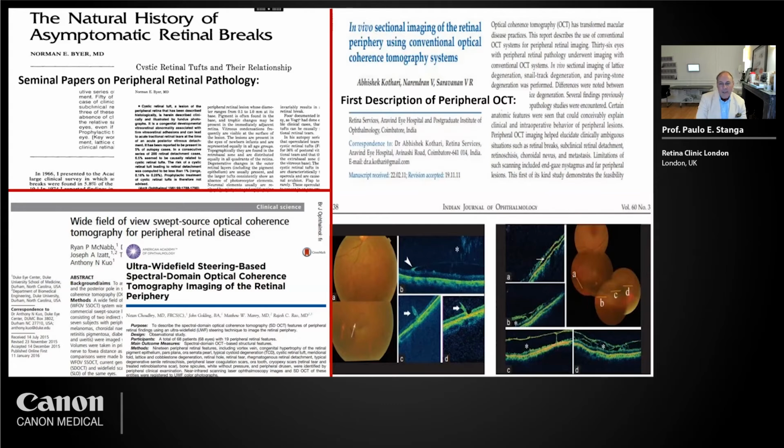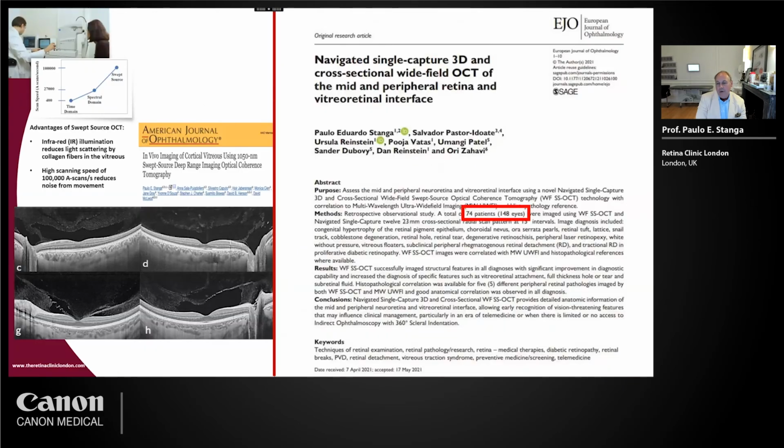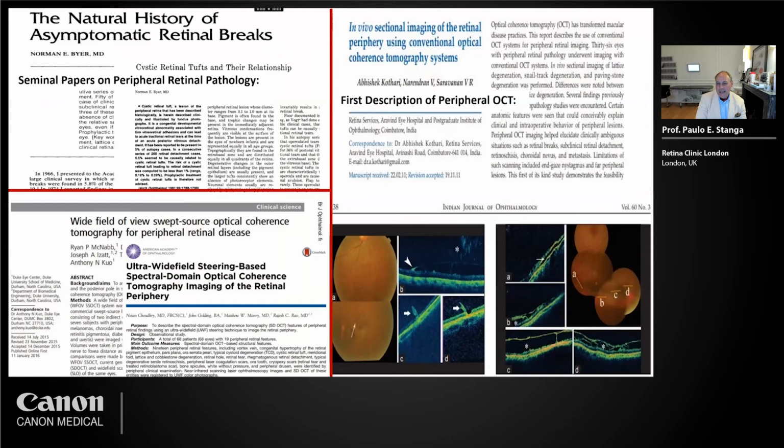There was no advanced imaging technology at the time, as we can imagine. It was Kothari and Saravanan who carried out the first description of peripheral OCT imaging, and this was published in 2011. Here you can see some of the results using short scans, single line scans.